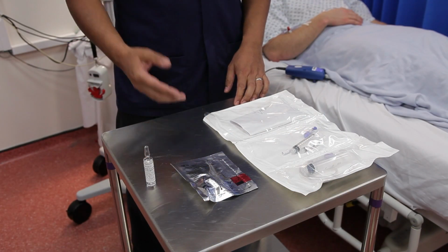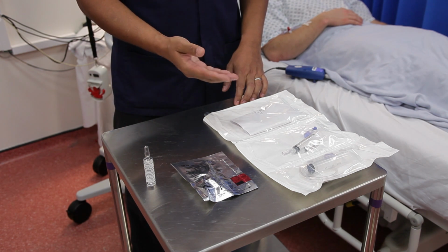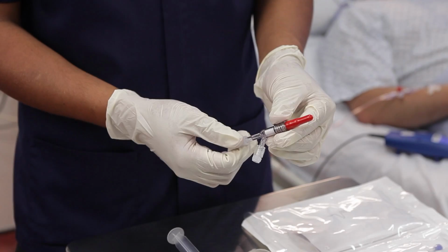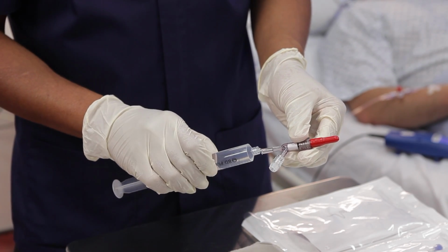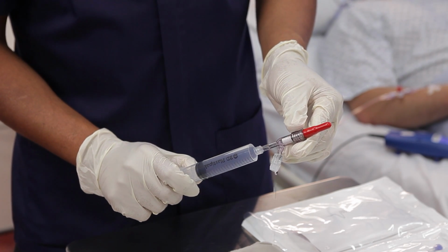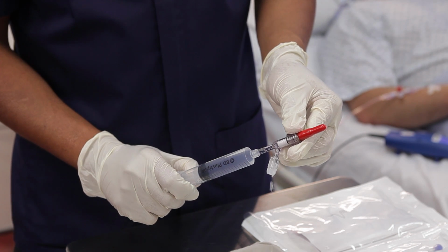Make sure you have your lithium chloride ampule, sensor and injector kit ready, and we'll start with the priming of the sensor. Remove the luer cap from the sensor and flush it with 20 ml saline. This is to activate the sensor, and you'll notice the wick change from a white to a grey color.